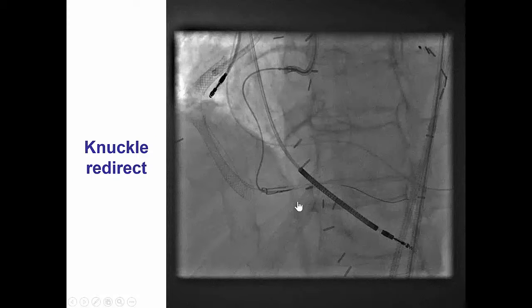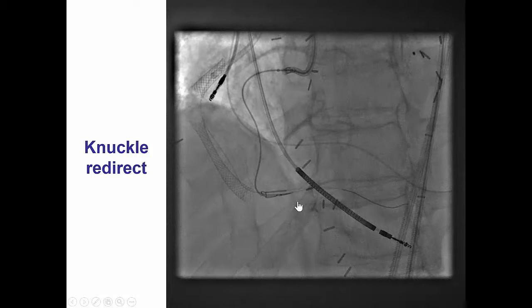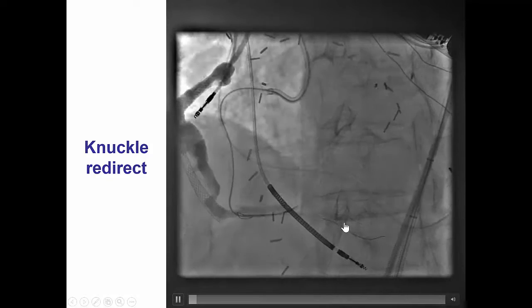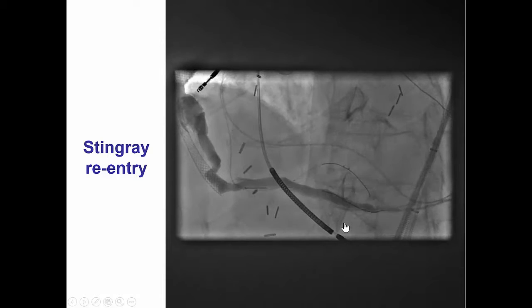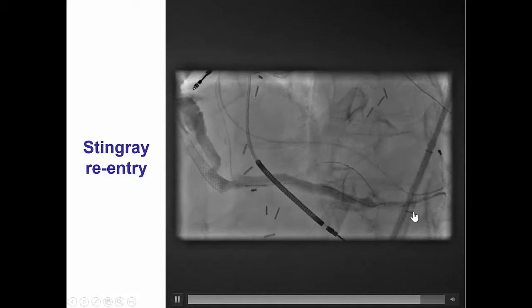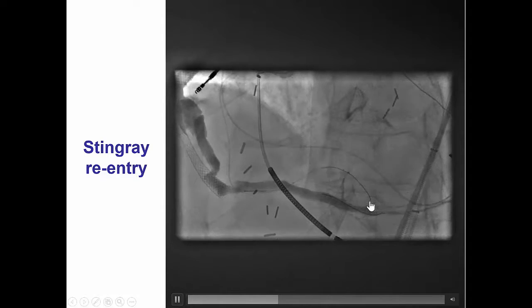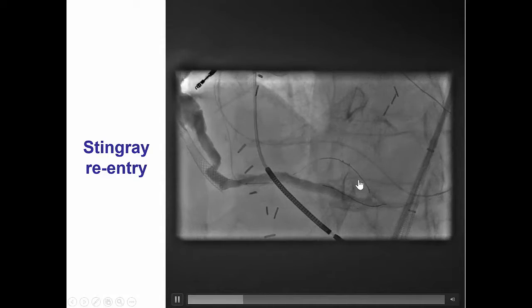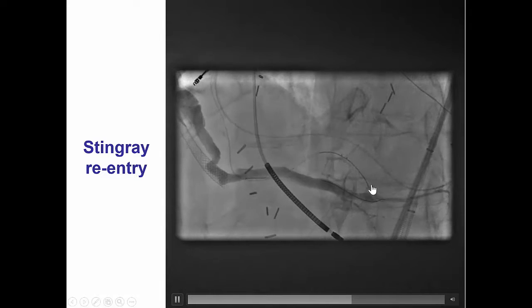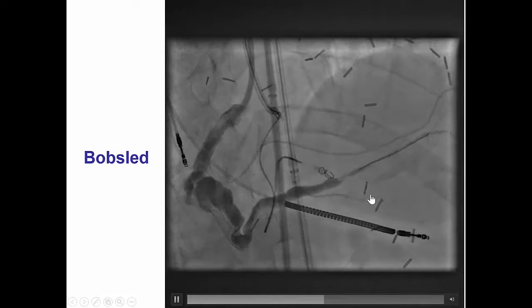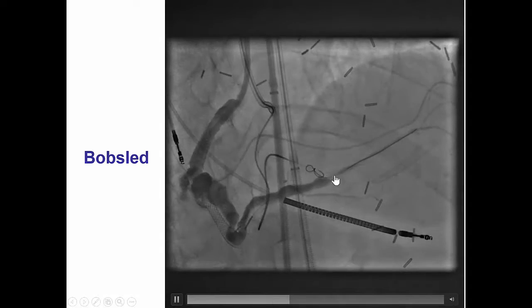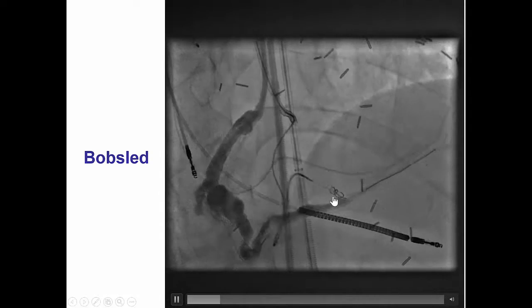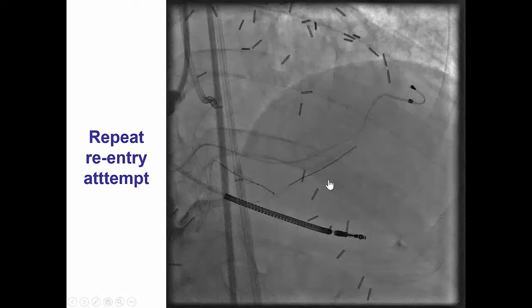We pulled back and then performed a knuckle redirection into the posterior descending artery, and we were able to advance a loop away from the proximal small branch all the way to the posterior descending artery. Then, with great difficulty, we were able to deliver a Stingray balloon all the way to the distal vessel in an attempt to re-enter proximal to the touchdown of the saphenous vein graft. We eventually used additional knuckling to advance the Stingray further down, a little closer to the touchdown of the saphenous vein graft.